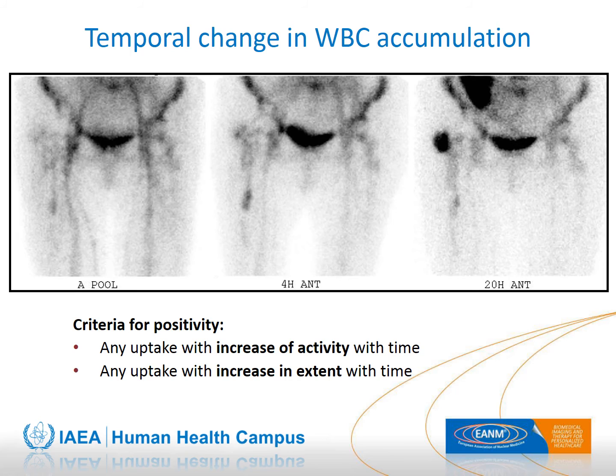So to confirm that one actually is looking at an infection by increase in WBC accumulation, we look for an increase in the concentration or the activity over time.